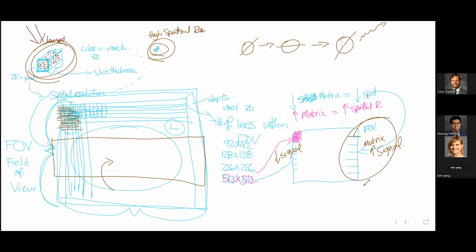We talked about what those values were: 50 milliseconds roughly for T2 at 1.5T and 3T, and for T1, 1000 at 1.5T and 1300 at 3T. Okay, what does T2 tell us? Water. When's water going to be in the myocardium? Injury, inflammation, edema related to decompensated heart failure. T1, there's something wrong with the ratio. It's non-specific. We don't know.